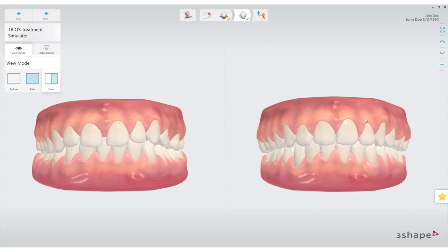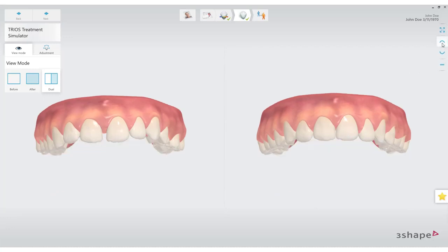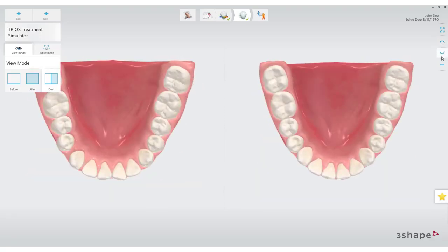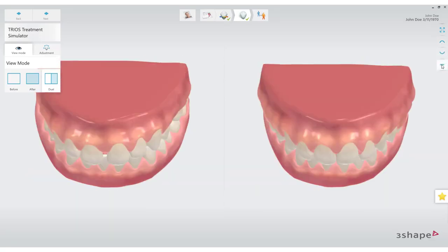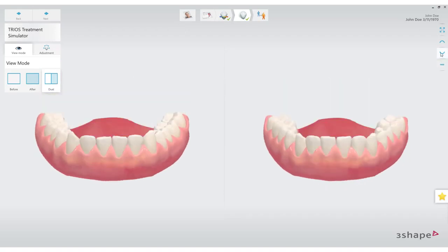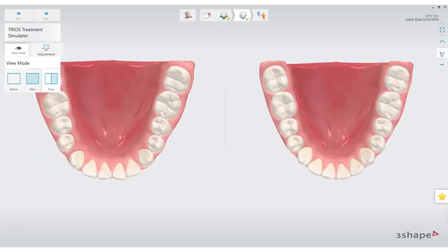Treatment Simulator enables dialogue with the patient about what can be accomplished with their treatment, helping and getting them more excited about the treatment. If needed, the simulation can be adjusted, helping the patient understand the decision process in finding the desired result.